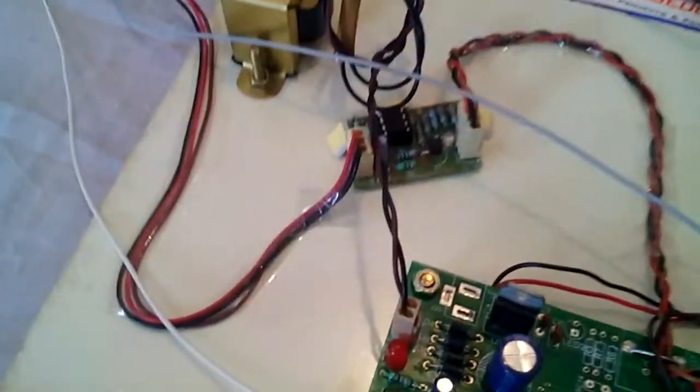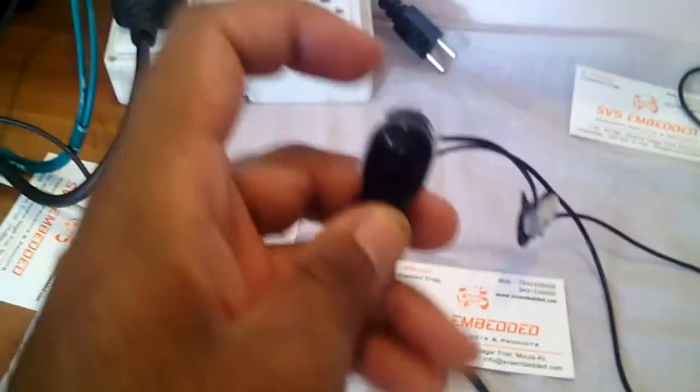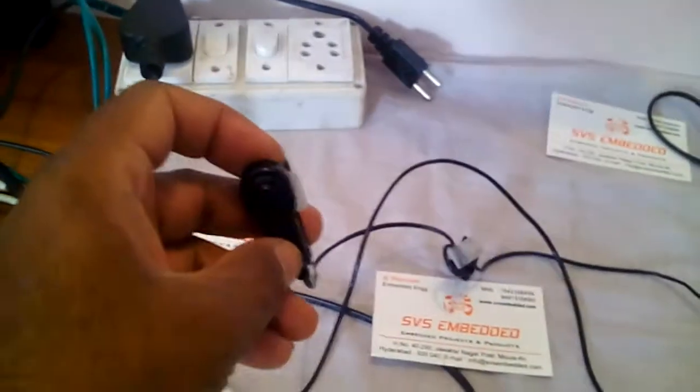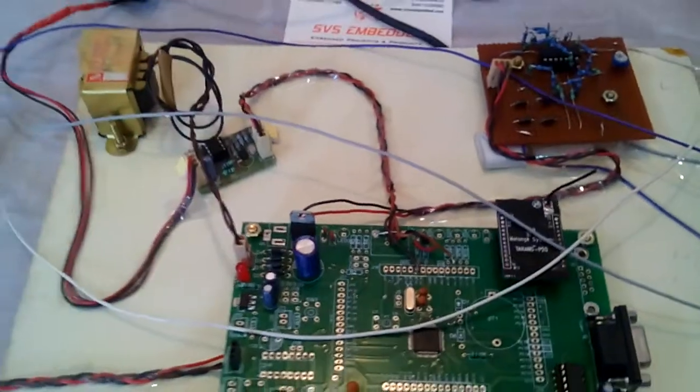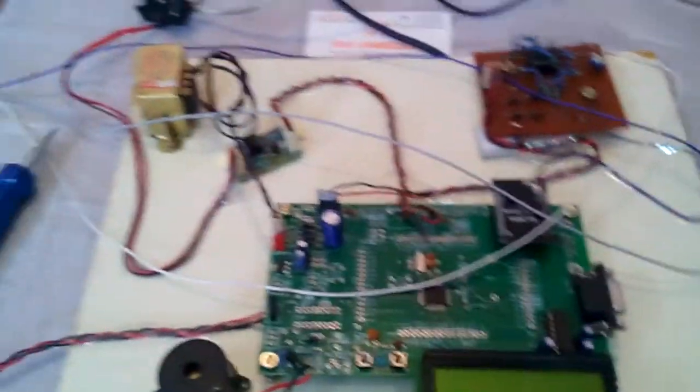I am using an LM358-based heartbeat sensor. This is the heartbeat clip — we connect it to the finger. It takes high and low pulse values. We count those pulses over one minute, and however many pulses come in one minute, that accurate output value is shown on the computer.